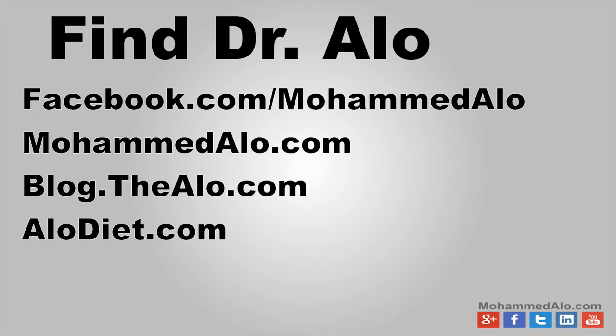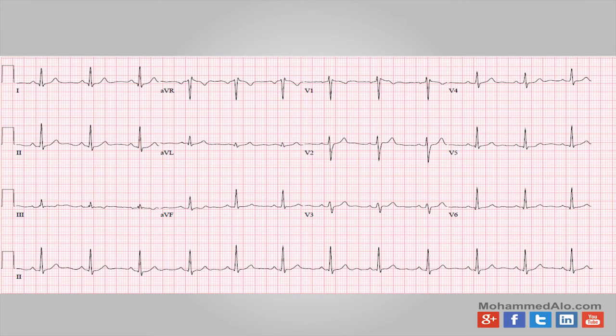So our first EKG here, you look at all the segments, you try to figure out what's going on with it. There's not really anything going on. Every QRS is preceded by a P. Every P has a QRS behind it. You look at 1 and 2, they're both upright. If you watch the basic EKG course, you know that's normal axis. AVF also upright, so you don't have right axis deviation or anything. Lead 1 looks good. No real elevated ST segments or anything, so we don't have really anything too exciting.